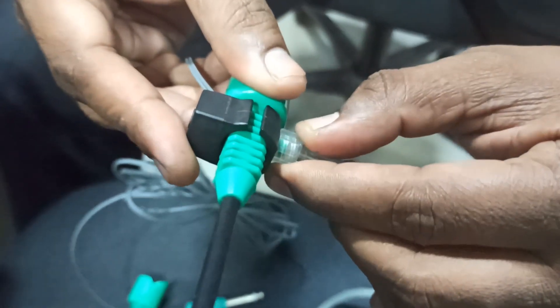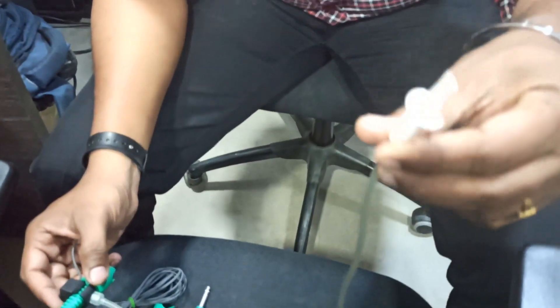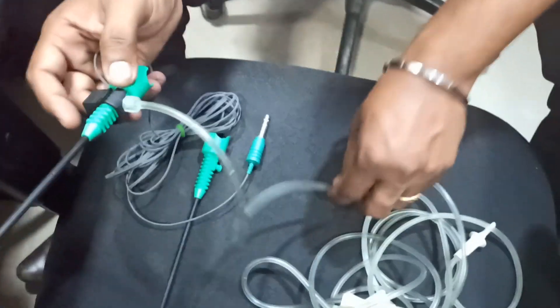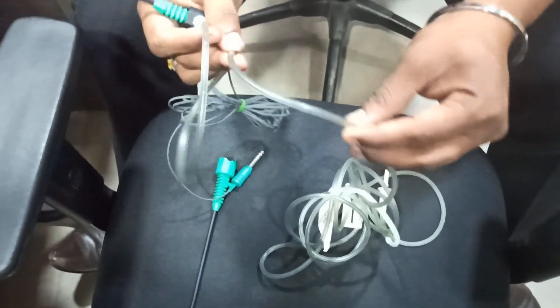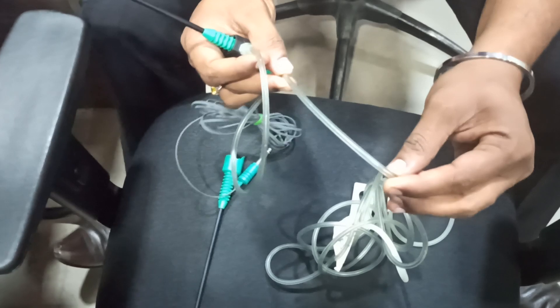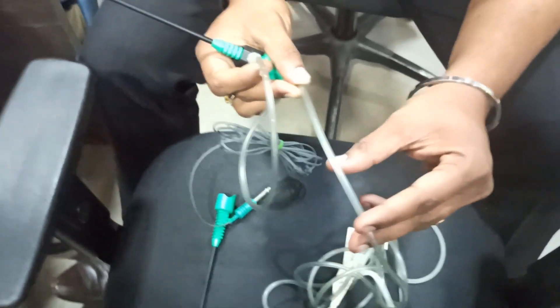After tightening, connect the other end to the saline water on the IV stand. If you are using an IPC pump, you have to connect it — whether it's Endoscope 2 or Endoscope 1 — to the IPC pump, generally on pump one in the upper pump.